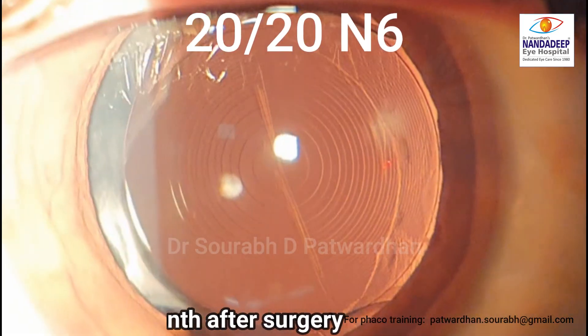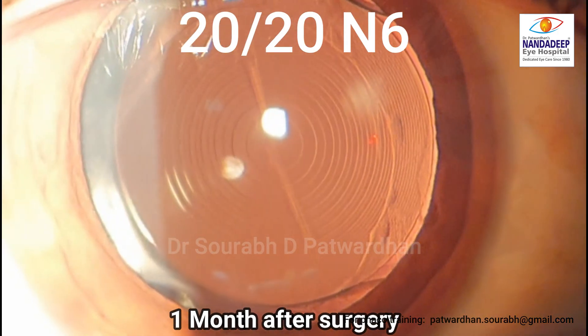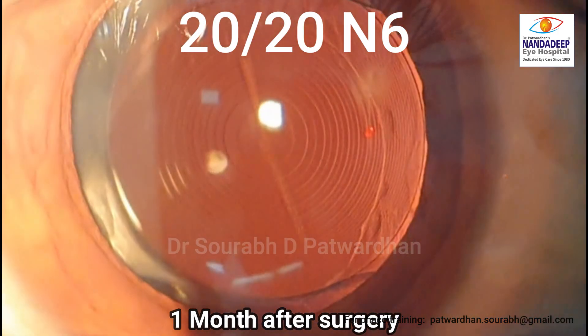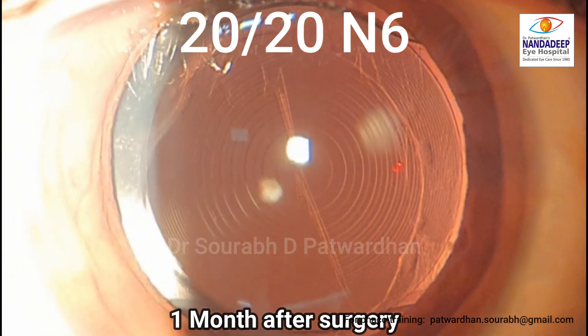This is one month post-operatively. As you can see, the lens is well centered. You can see the posterior capsule rupture, but the IOL appears stable and the patient has great vision.